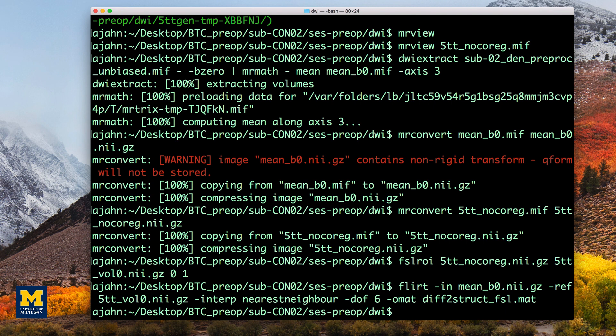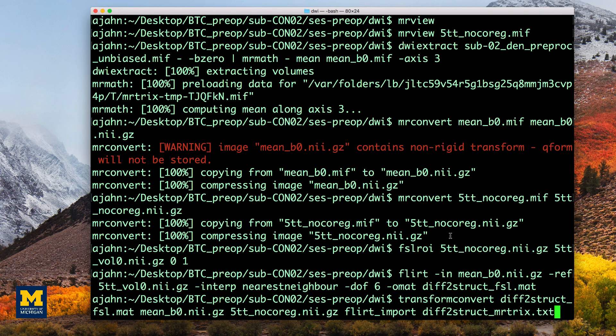Now that we have generated our first transformation matrix, we will need to convert it into a format that can be read by MRTRIX using the command transform-convert.